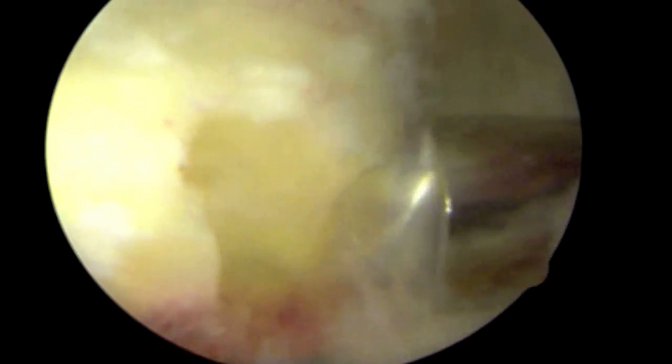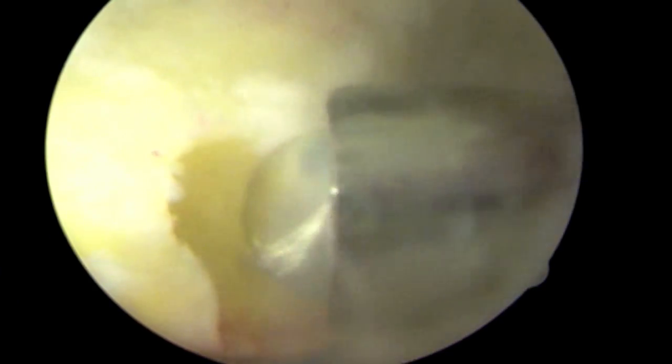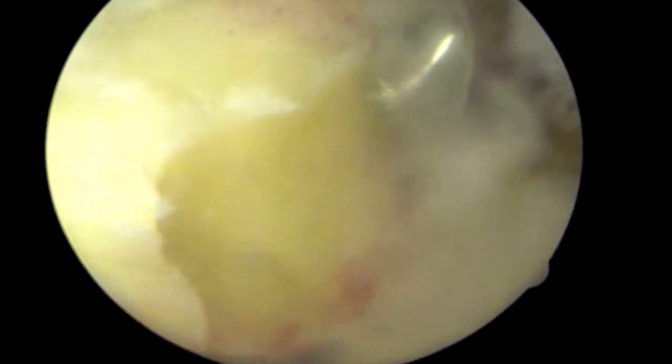In this view, the burr is inserted in order to recreate a more normal circular contour of the acetabular rim prior to repair of the acetabular labrum.